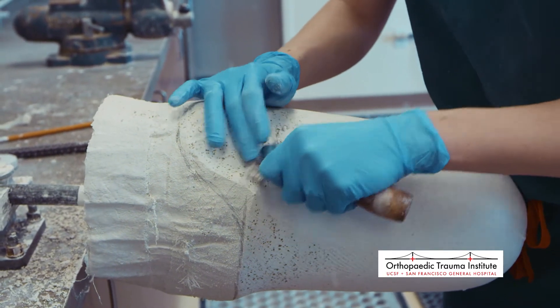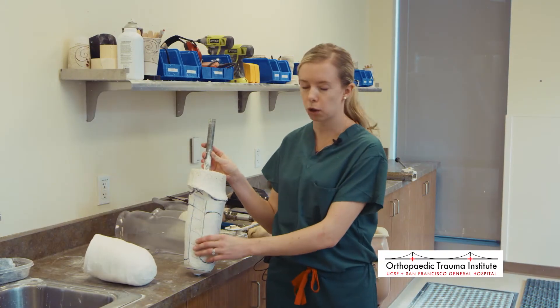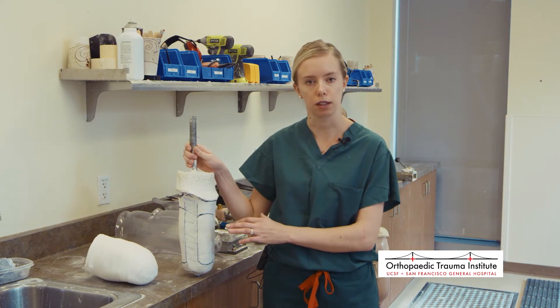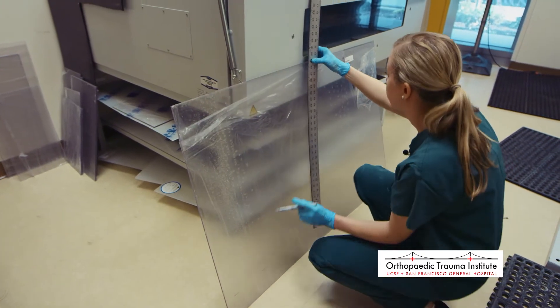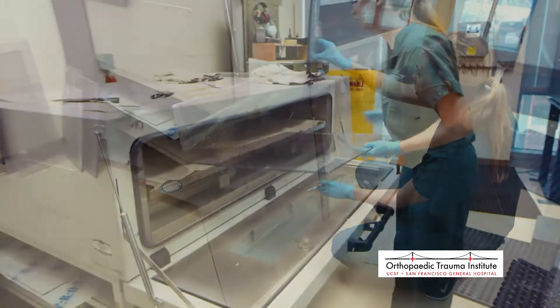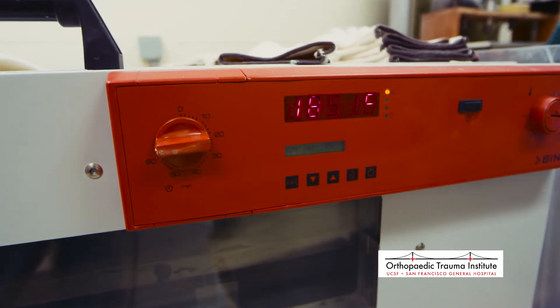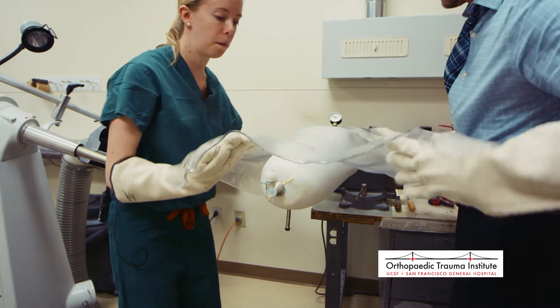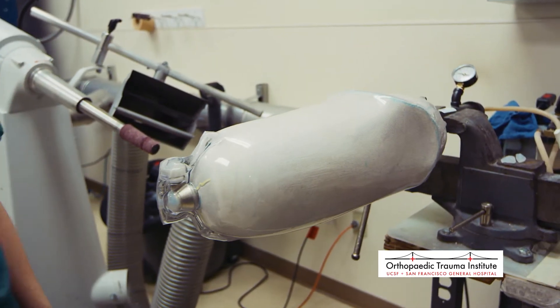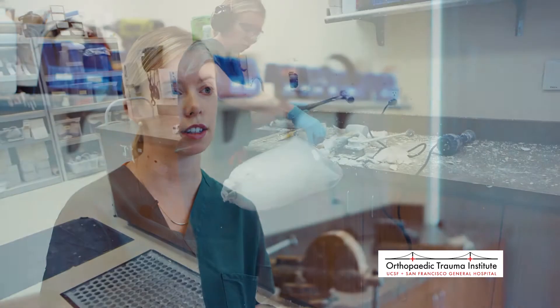That's the modification process. A plaster model will resemble the shape of the limb and we'll make the prosthesis — the socket — off of that. Once everything is modified and ready, we heat up a sheet of plastic in the oven that is vacuum-formed around the positive model, becoming a negative copy of the leg as we've modified it. That's the test socket.